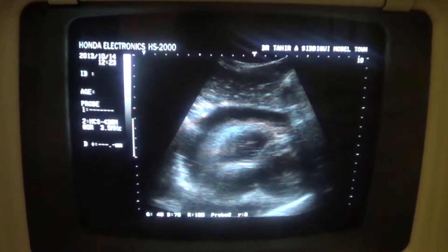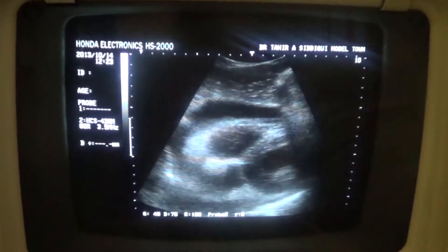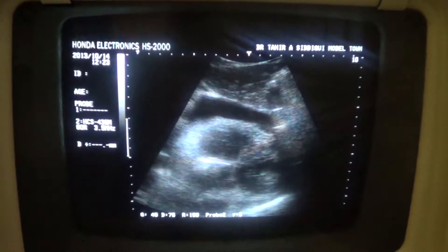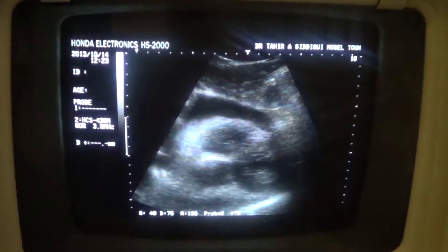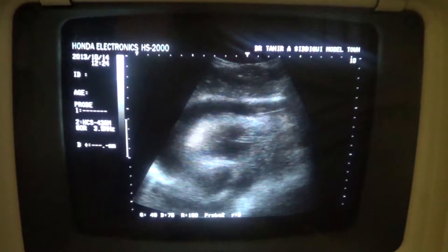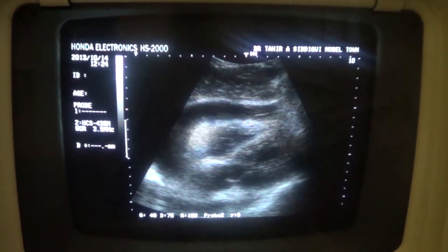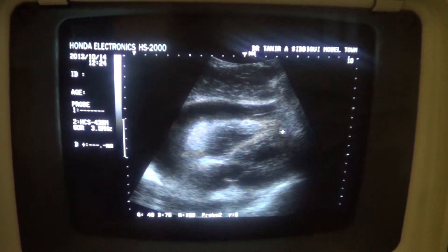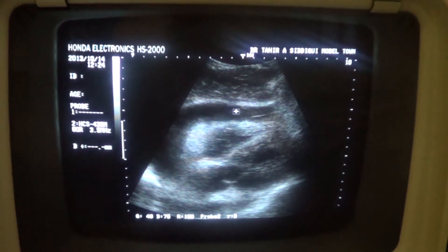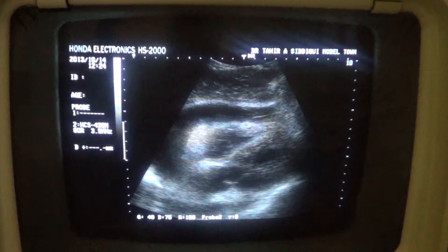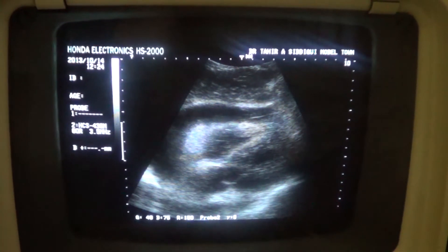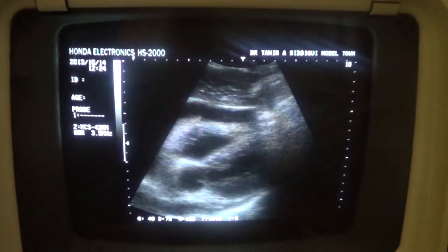I am showing you a sub-costal view in which you can see the heart, its chambers. Heart size is normal, chambers are normal. What we are finding — what we see — is fluid in the pericardial space. This is the heart, and this black strip is the fluid in the pericardial space. So this is the case of pericardial effusion.